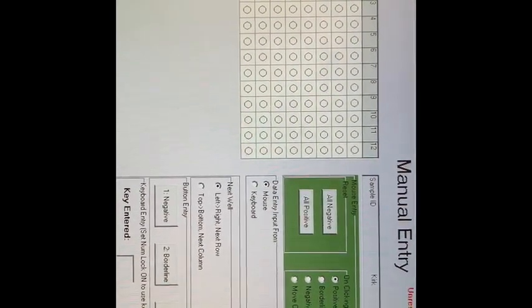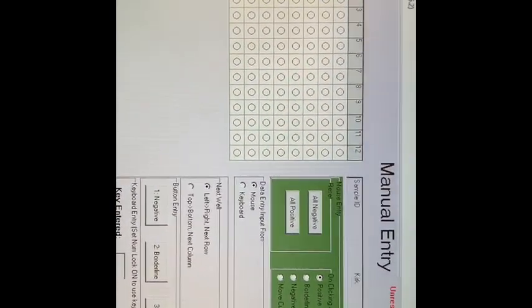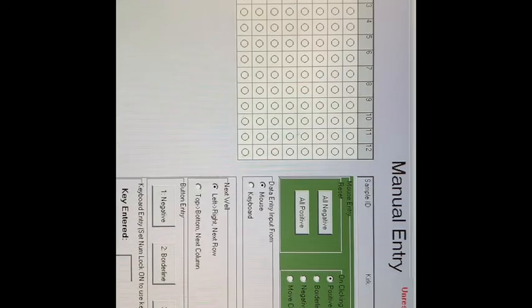And I'm going to put it into the computer and indicate whether all of those wells are positive or negative or borderline based on the purple color. And I have to do this manually because that's all we have. Anyway, I'll be back, and I'll show you after I do that.